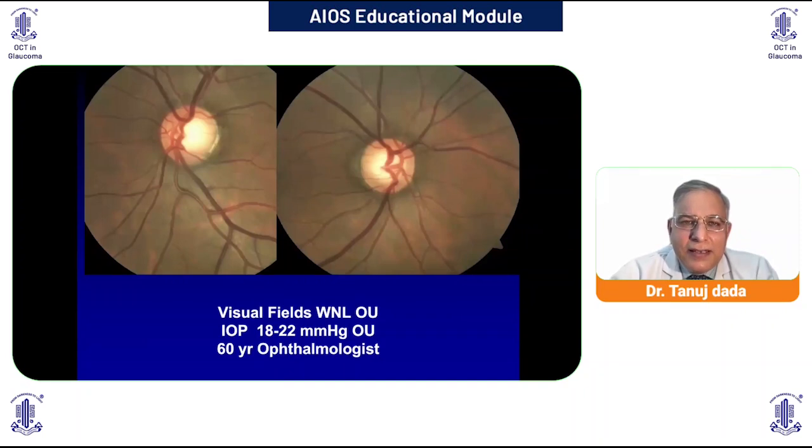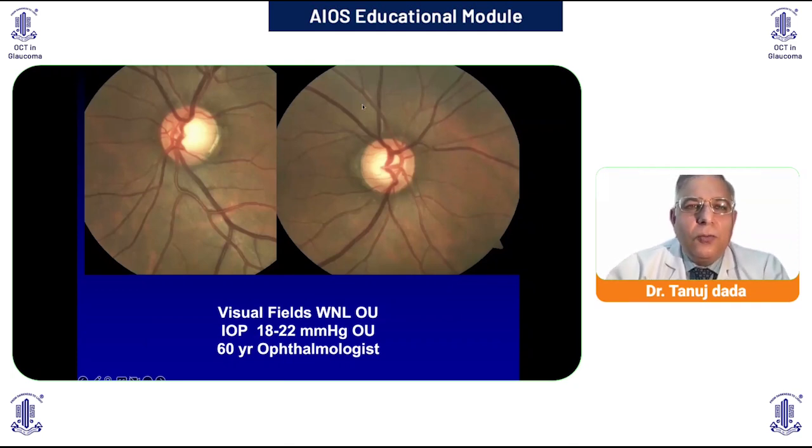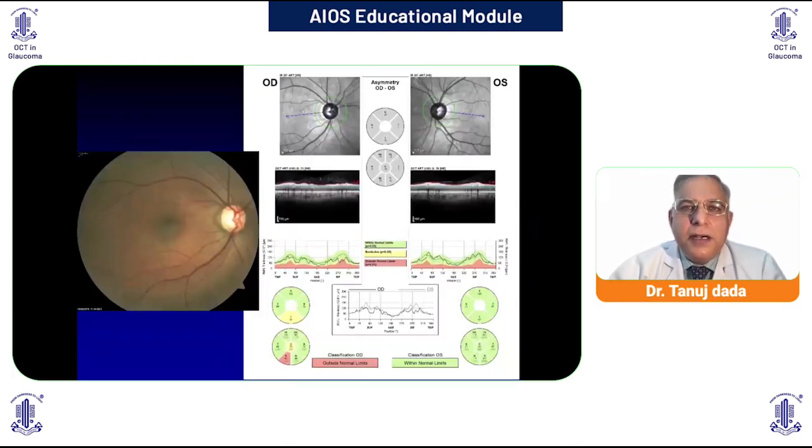Now, a very interesting case. So the patient came to OPD, visual fields were normal, and he was missed. So we said, you don't seem to have glaucoma. It looks like physiological cupping, fields are normal. So then we said, send the patient, but at least get an OCT done. Now OCT of the right eye showed there is a dipping of the inferior RNFL. You can see the peak as compared to superior has dipped. And the temporal inferior sector shows there is an abnormal finding.